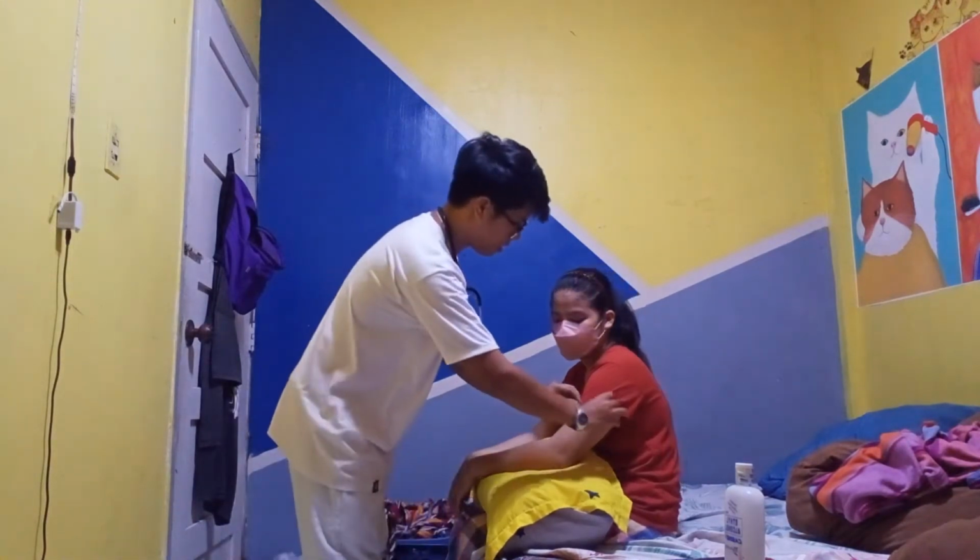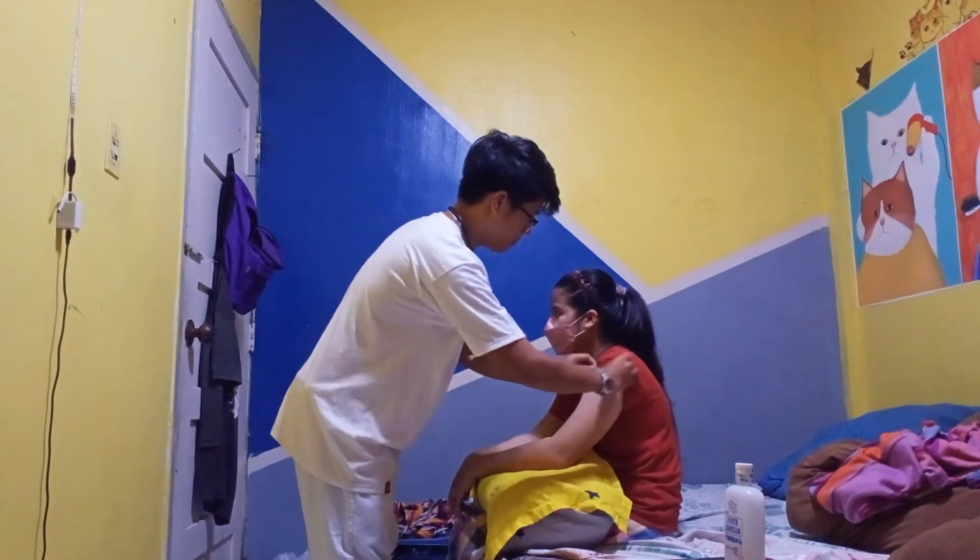So the next is move clothing or gown away from shoulder and arm. So the rationale is to expose axilla for correct thermometer placement. So ma'am, itataas lang po natin ito ma'am.